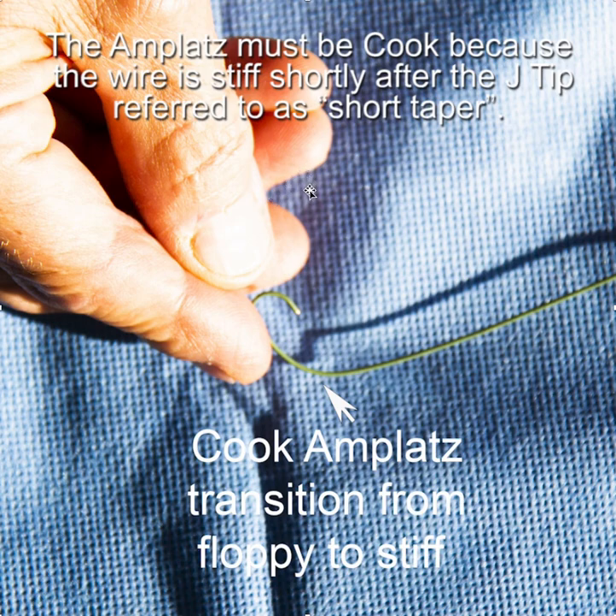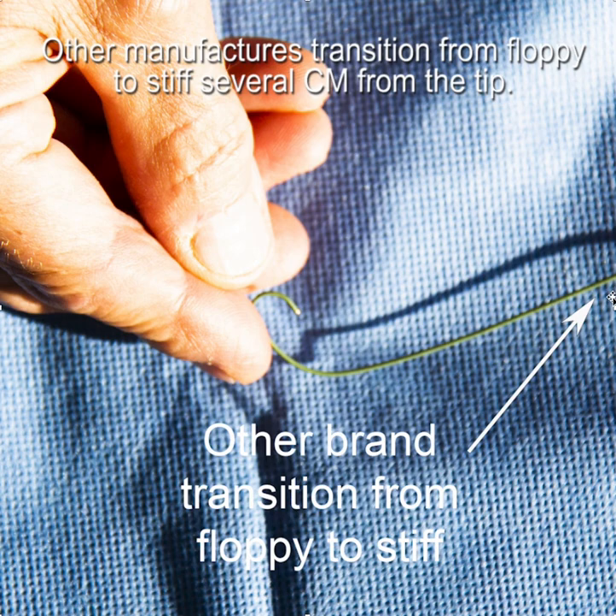A couple of really important points: the AMPLAT wire must be a Cook wire because the Cook AMPLAT wire gets stiff shortly after the tip — this is referred to as a short taper. You can see that when you push the tip of the Cook AMPLAT wire against your finger, only a very short floppy section bends. The Cook AMPLAT wire becomes stiff right after the tip, whereas with any other brand, a much longer section would be floppy, as other manufacturers transition from floppy several centimeters from the tip.